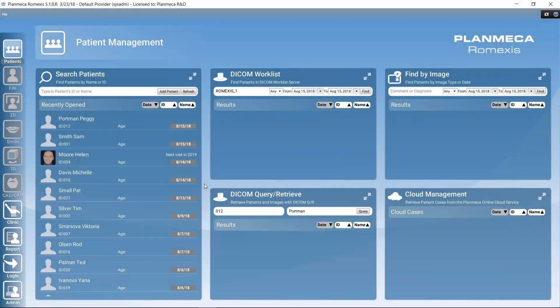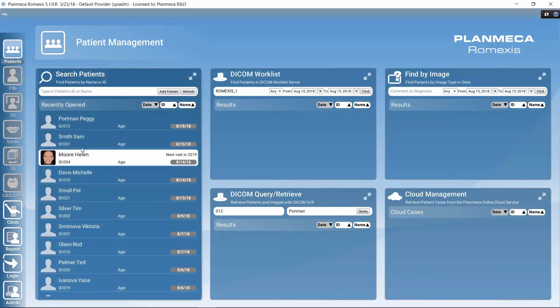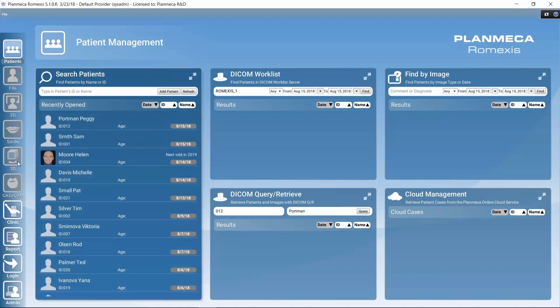In this tutorial we will cover the basics of working with the 3D imaging module in PlanMeka RomeXis software. We'll take a look at how we can get there, how we can navigate around, how we can view the list of 3D data that the patient has, and we can take a look at the different submodules. There will be separate tutorials about the submodules. And finally, let's take a look at how we can export images.